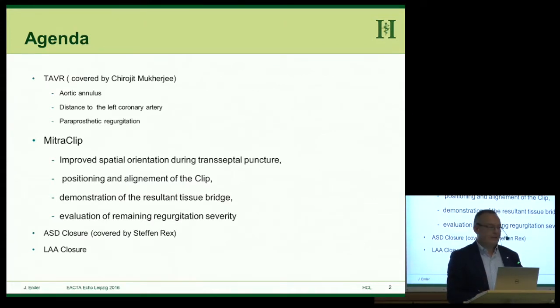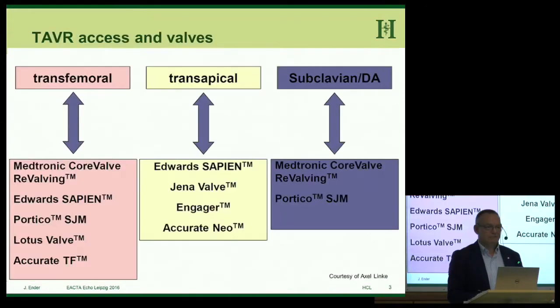Who is involved in hybrid or Cath Lab echo? Some. And you use the 3D? Yes. Not so much. Maybe I can convince you.